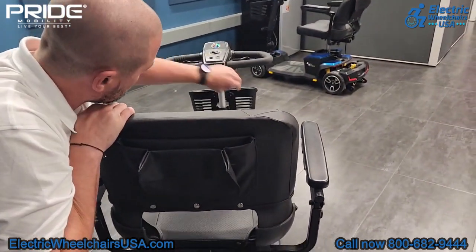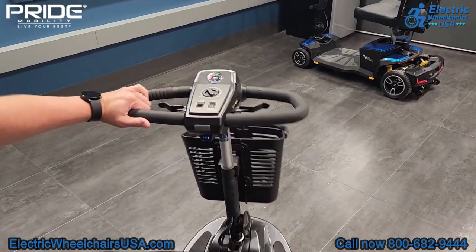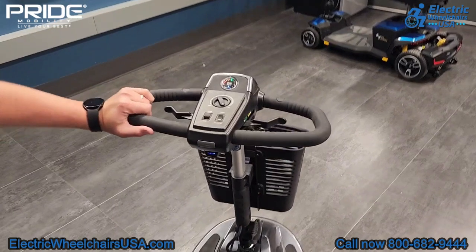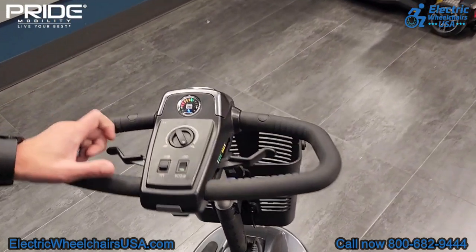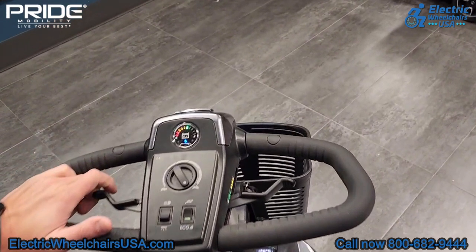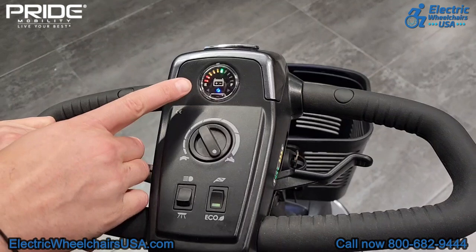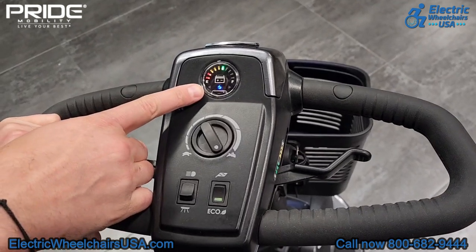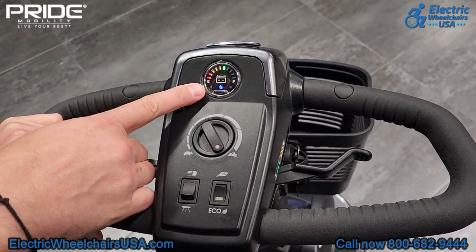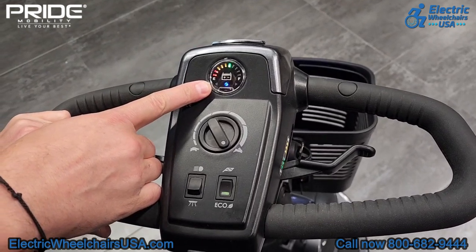And on the tiller, this is actually a delta tiller, so you can see it has an oval shape, so people that have limited dexterity in their hands, they can rest their wrists on this bar that's closest to you and then use your fingers to accelerate the scooter. This is your battery gauge. You can see right now this scooter is about 60% charged, and as the battery starts to deplete, each of these bars will disappear, so you can easily tell when it's time to recharge your batteries.